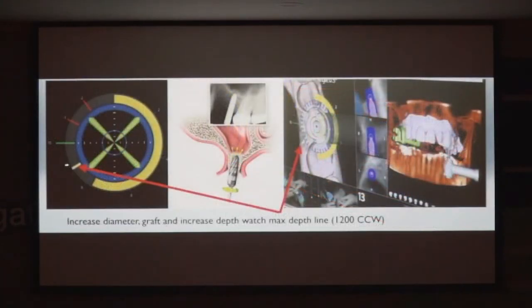So again, you drill and drill and drill until you get to the 3 millimeter burr, and then you can go beyond it. You never want to put your burrs more than 3 millimeters past the floor. And when I start going up, I use Dynagraft, which is a flowable bone graft. Some other people will use cancellous bone and pack it in there. And I'm going to show you the literature on this in a moment. And you can get 4 to 8 millimeters of augmentation with this procedure. Predictably, I think you can get 4.